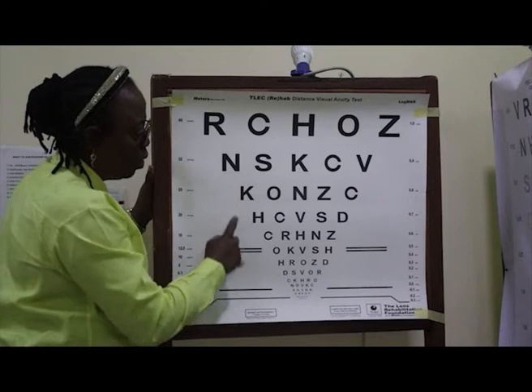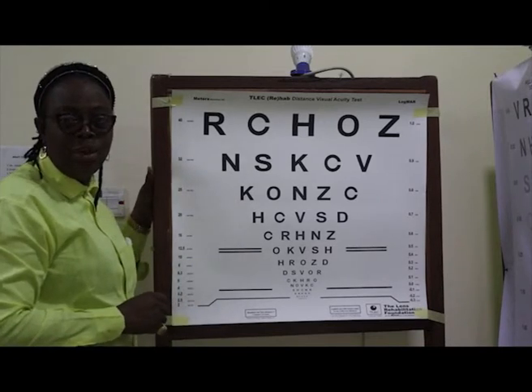So that is how to record the visual acuity using LOGMAR notation.